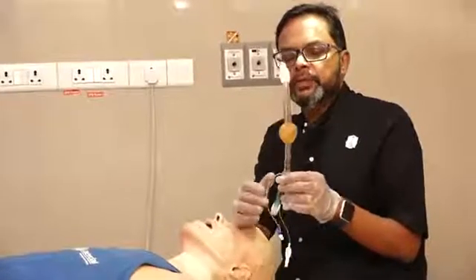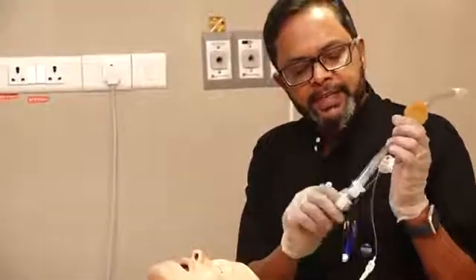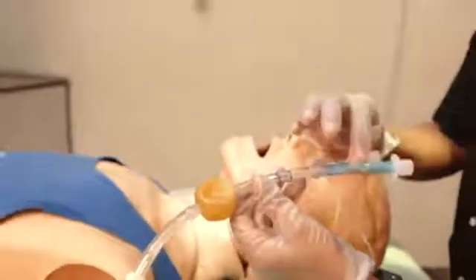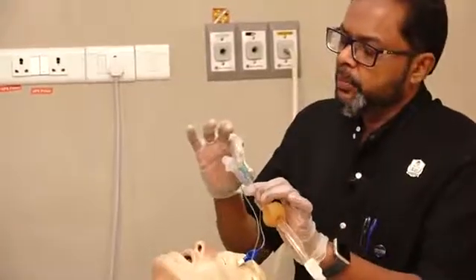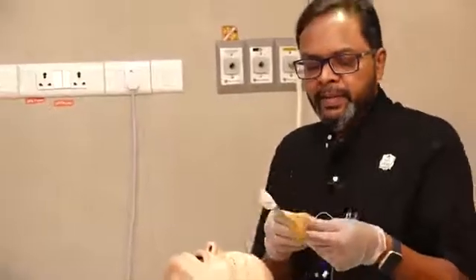This is another blind insertion device, what is called a combi tube. Basically it is a combination of two tubes — that is why it is called combi tube. You can see there are two tubes: tube number one and tube number two. Tube number one is the blue one and tube number two is the white one.